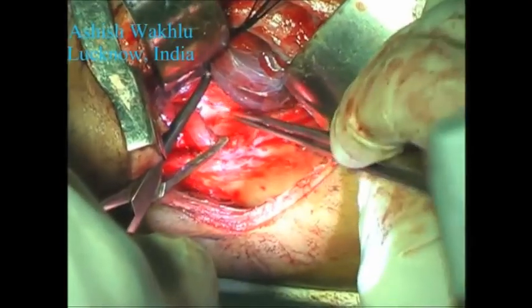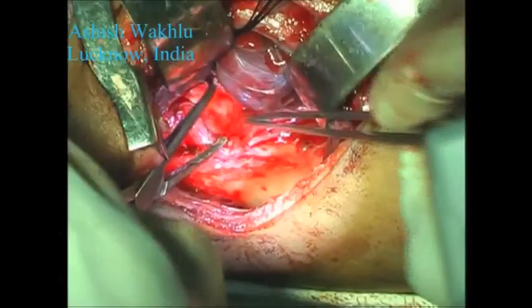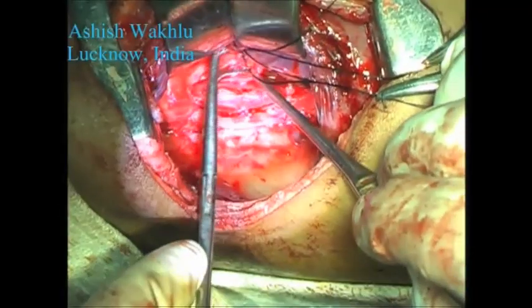Now we can see the trachea coming into view there, and the stump of the right main bronchus will underlie that lymph node.